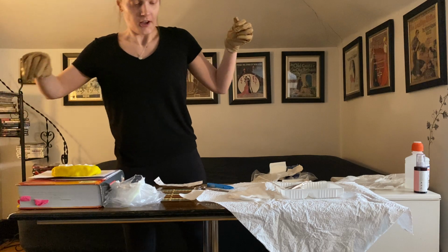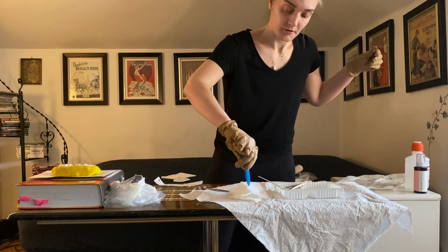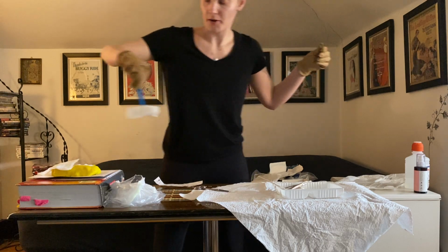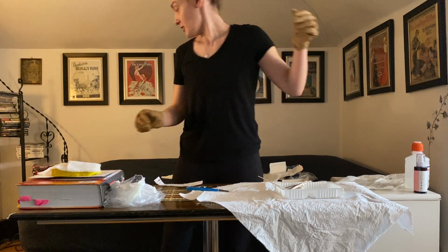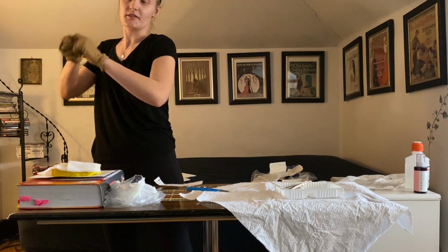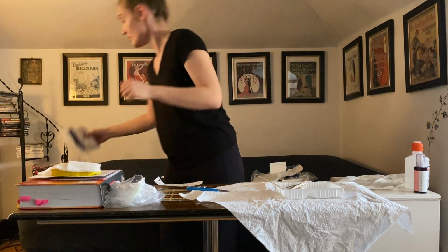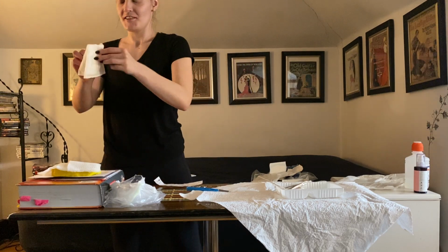Okay, so now I'm going to use my forceps to cover that. And again, I'm going to be showing you the packing at the end with the camera. Okay, and then I'm going to be taking my gloves off like this, and then performing hand hygiene, and putting my abdominal pad on.